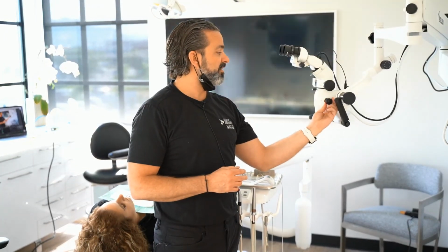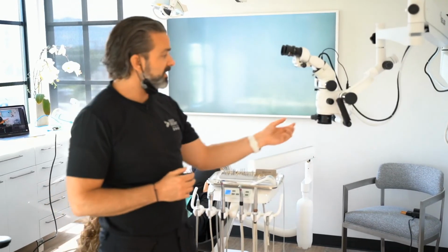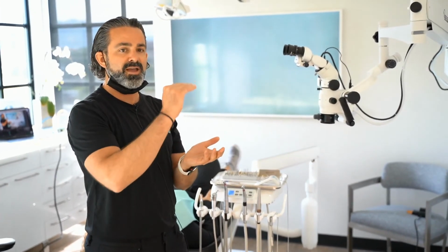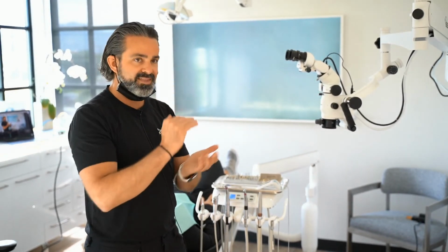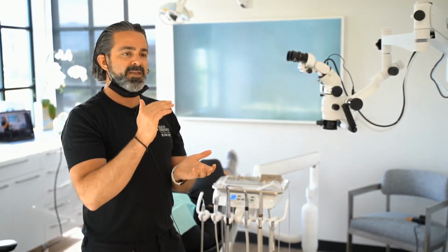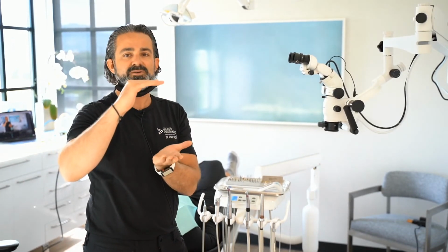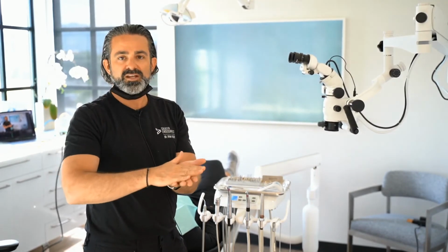4 and 5 are really important in finding endoanatomy, so pulpal floor anatomy. 6, although when they do the steps, it's the incremental changes between the magnification factors, the more subtle, less of a jump, is why you like that. Because as I go up in magnification, my depth of field goes down. So if I'm up at a 5, it's hard to actually focus on the occlusal surface and the pulpal floor. So just that 5-6 millimeter difference isn't all in focus, which doesn't matter if I'm only looking at the floor.